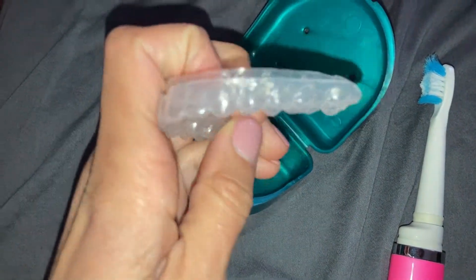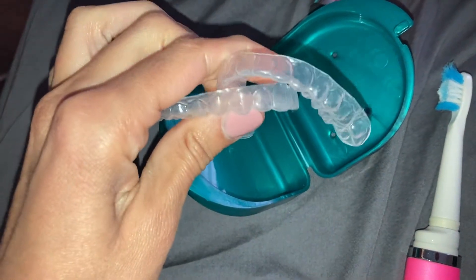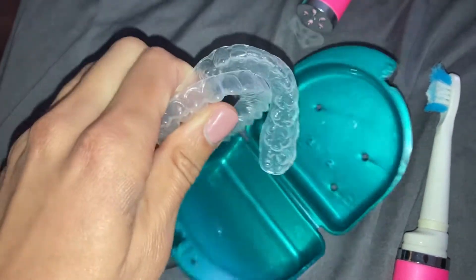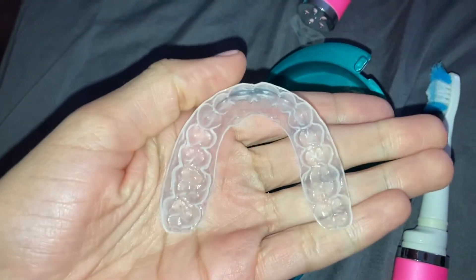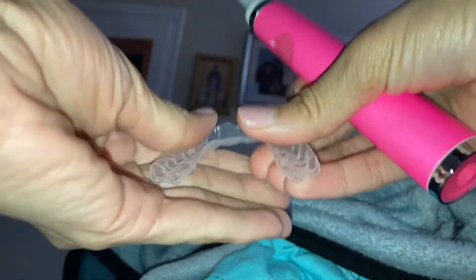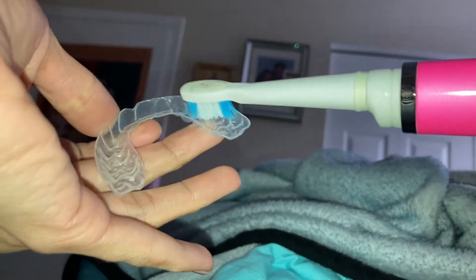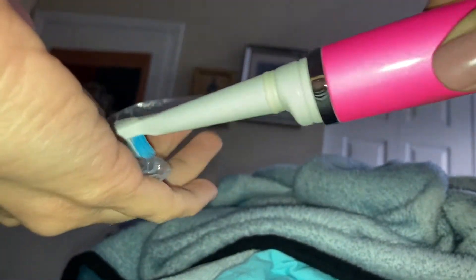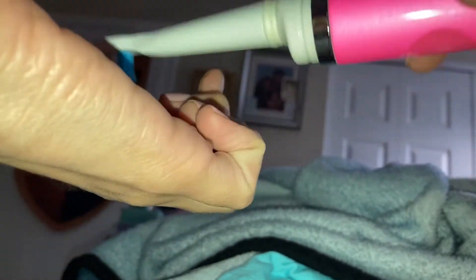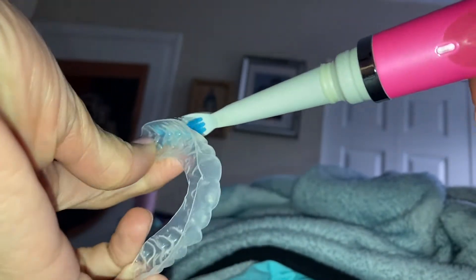I have not used these retainers in a long time, so they're kind of cloudy and gross. They can dry out if you don't use them — they're plastic. So what you're going to do: have your retainer in your hand like this. If you hold it the wrong way it could snap in half. Get your toothbrush with the antibacterial hand soap and scrub the retainer really good in the palm of your hand — all of it, basically like you're brushing your teeth.